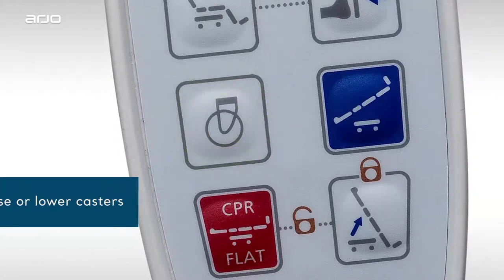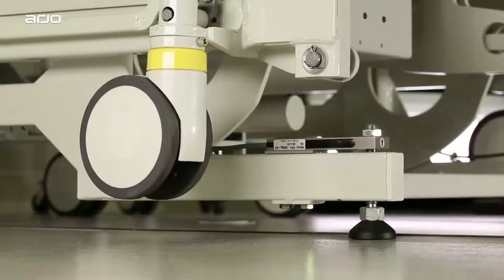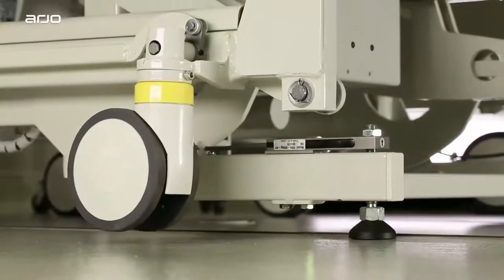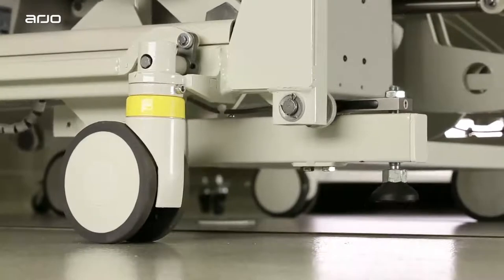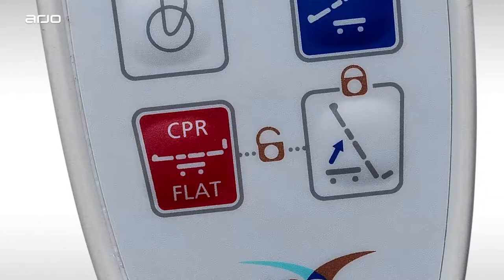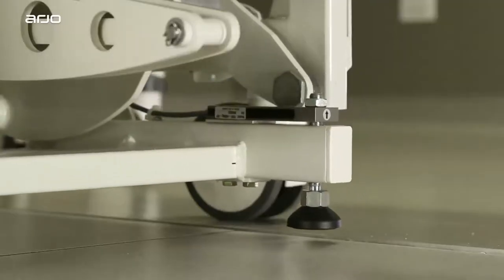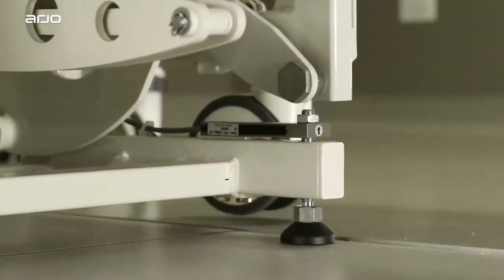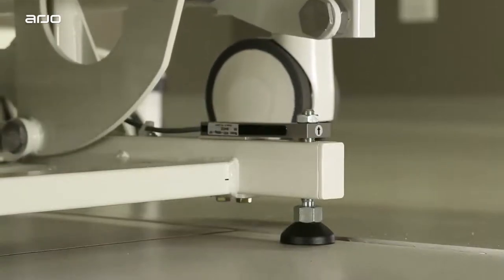Press the casters button to lower them. Always make sure you listen for two beeps when raising and lowering the casters to confirm the action is complete before proceeding to other functions. Press the CPR or the raise bed height button to disengage the casters and place the bed on its feet. The casters will disengage so the bed can remain in a stationary position.